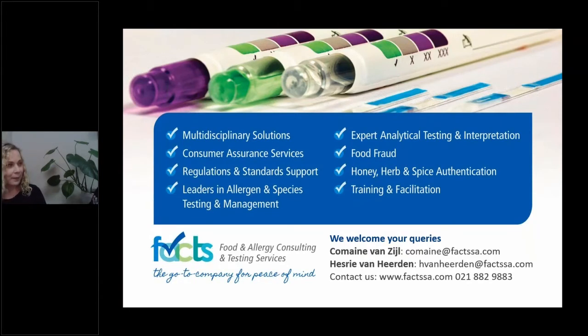I'm not sure how much of you can see me. I know the plant is maybe taking a bit more of the spotlight, but no, there's not one test that detects for all the allergens. Like I mentioned, there's total protein indicators, so it detects protein from any source, but that means it can be allergenic or it can be any type of other protein. And then you get specific systems for specific allergens.